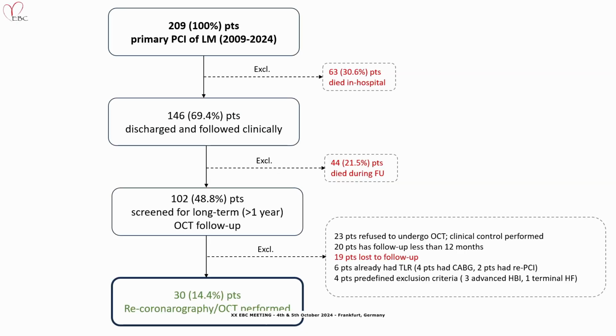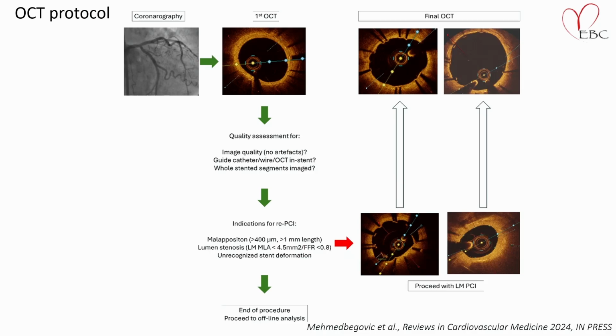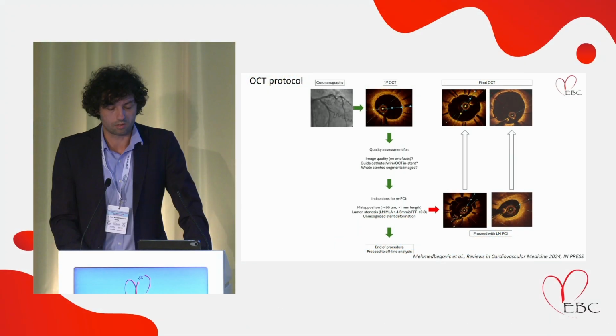So we ended up screening 102 patients and finally performing OCT in 30 patients who consented to undergo angiography and OCT. They did not have any symptoms. They did not wait for the coronary angiography. They were screened and followed up by the investigators. This was our protocol, which we conducted in every patient.